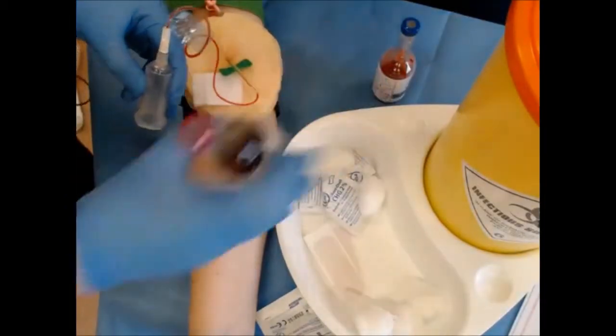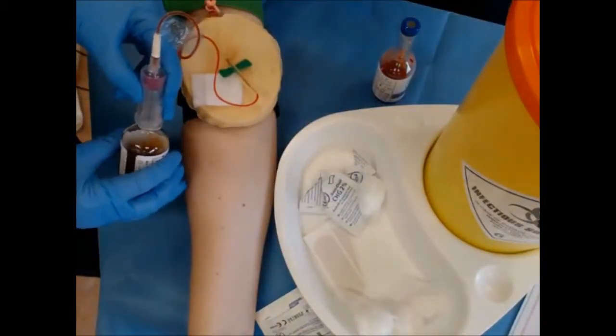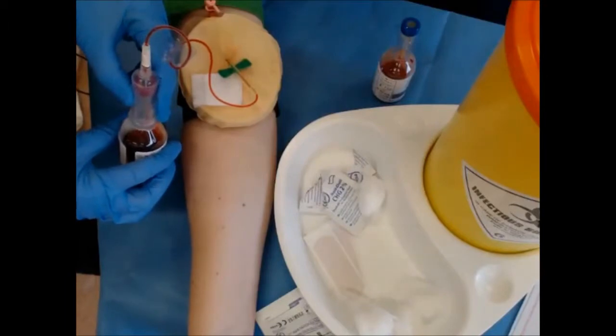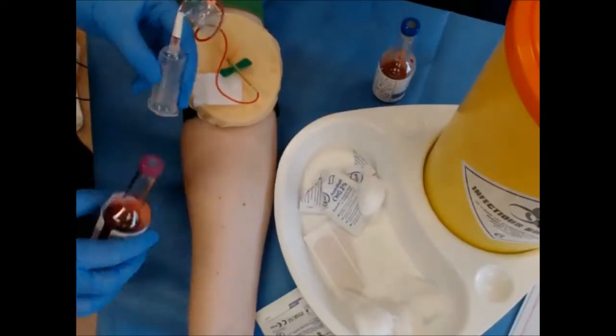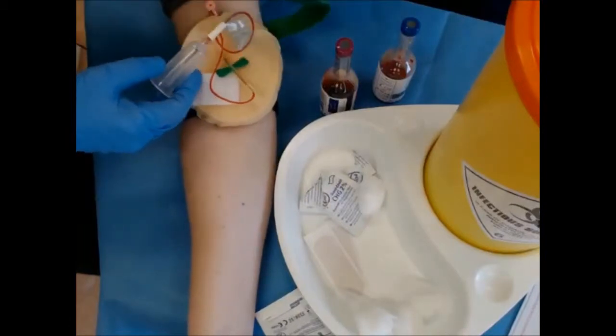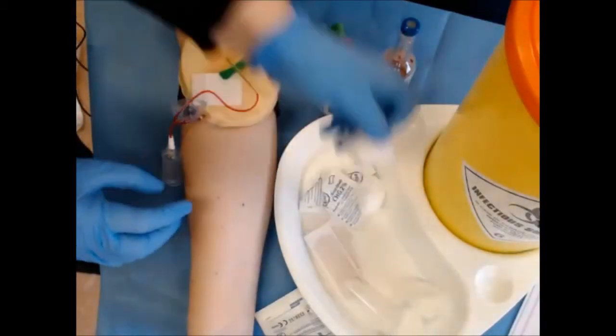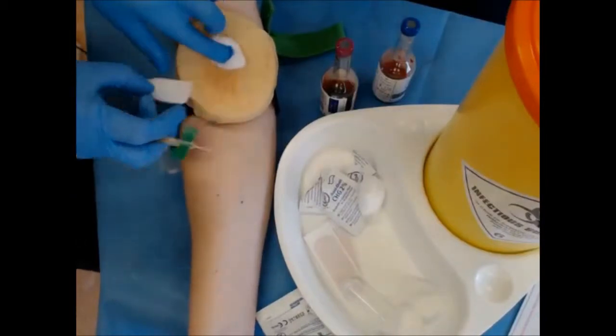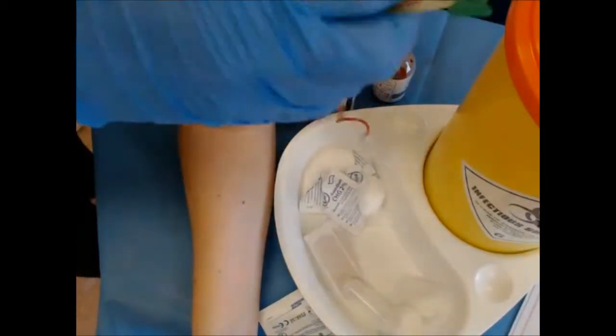Remove that. Then take your second sample, which is your anaerobic and again, fill for 8 to 10 mils. Once you have obtained your sample, release the tourniquet from the patient. Apply a cotton wool ball and ask the patient to push or to bend up their arm and dispose of the sharps.